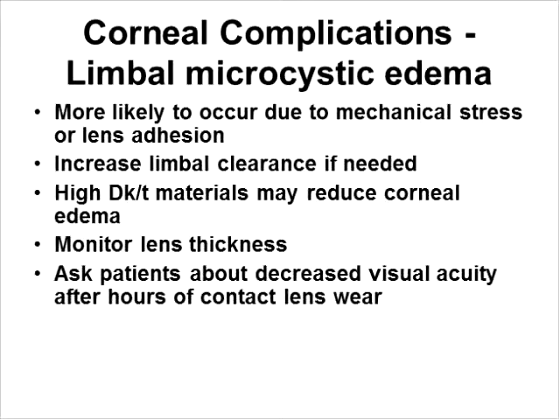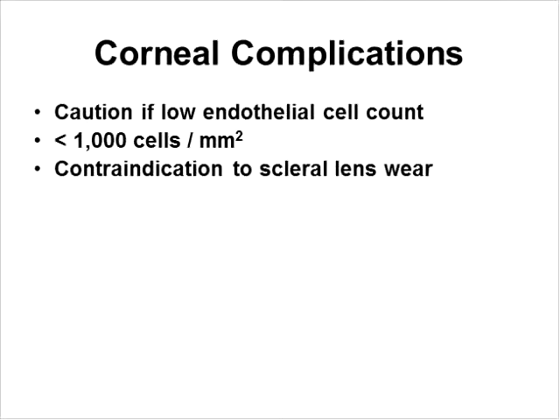Moving on to limbal microcystic edema, this is more likely to occur when there's mechanical stress. Sometimes it's helpful to increase the limbal clearance or increase the Dk/t in the material. Monitoring lens thickness is also helpful. If you see limbal microcystic edema, it might be beneficial to ask patients about their vision, especially after wearing the contact lenses for many hours. A contraindication to scleral lenses is a low endothelial cell count.